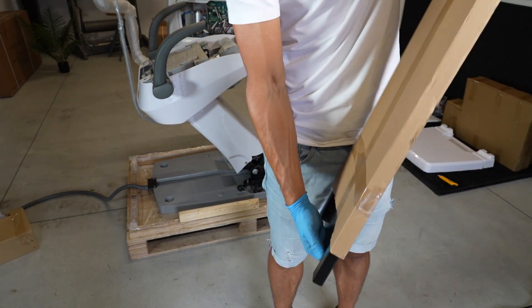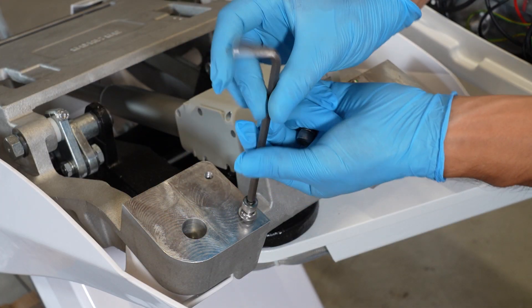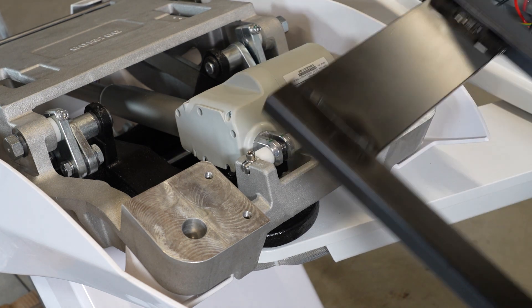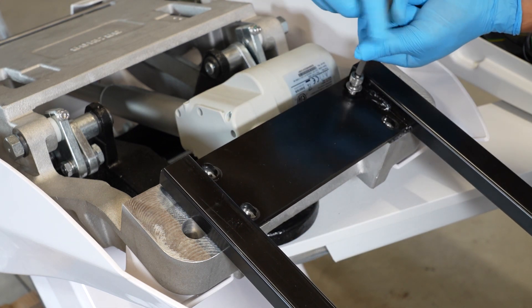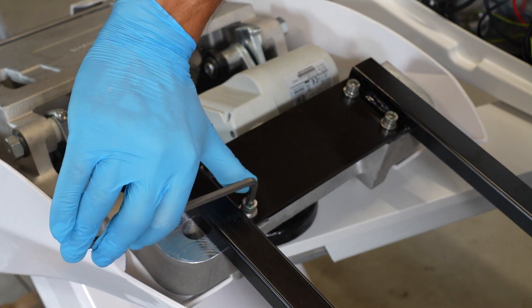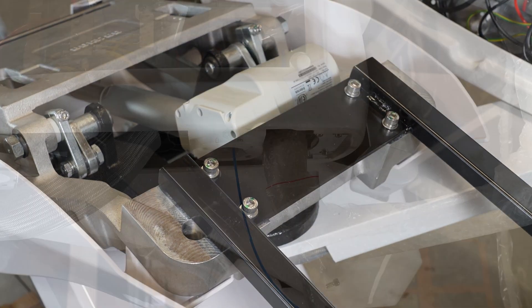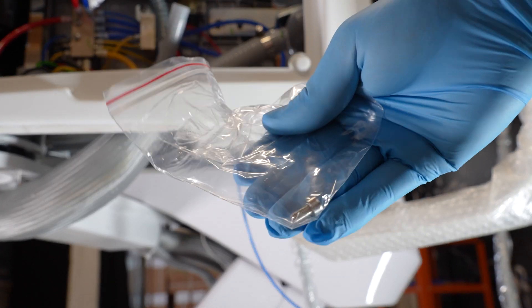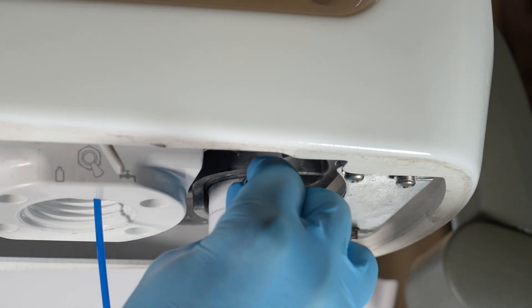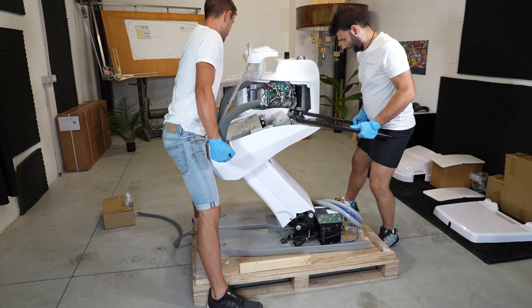Place and fix the seat metal frame. Put the set screw in the assistant tray arm. Remove the dental unit from the pallet.